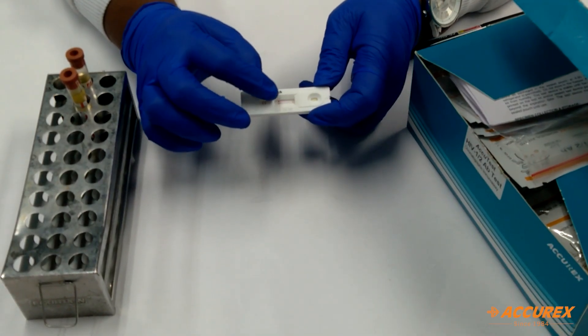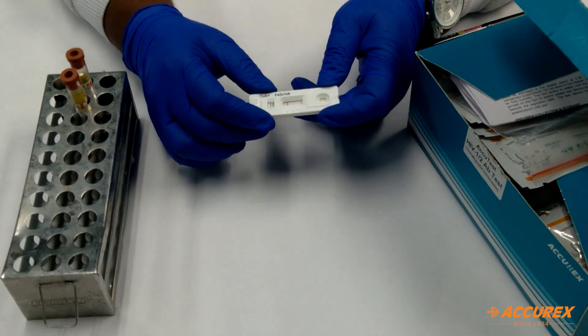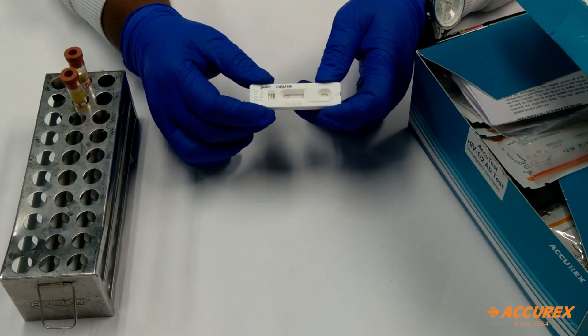After 20 minutes, you can see the control line has developed. There is no line at HIV-1 or HIV-2. This means it is a negative result. In this way, you can give the result to the customer or patient in 15 to 20 minutes.